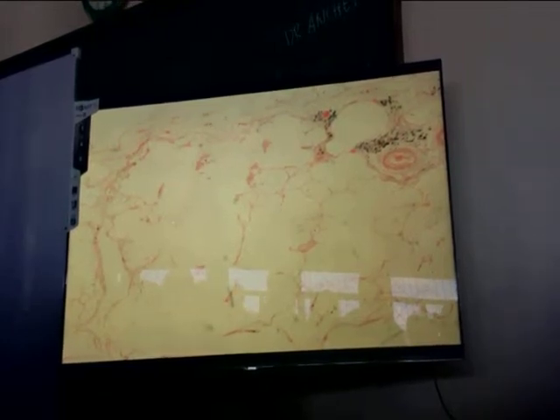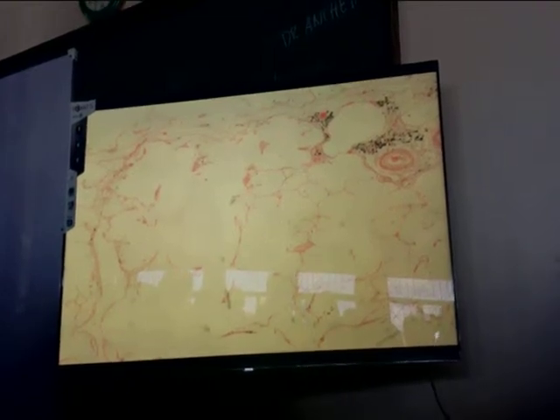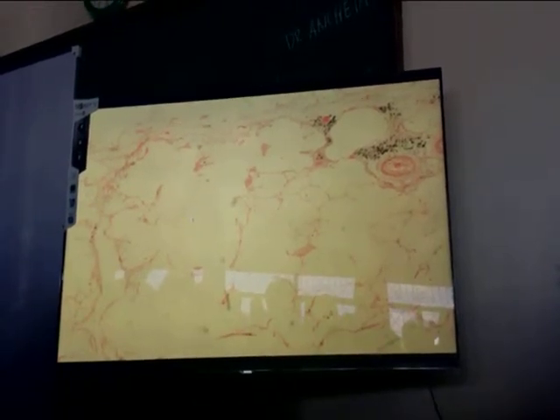That is why we are now able to see dilated alveoli instead of that normal size of an alveolus. So these pointed alveoli are already markedly dilated because some portions of their wall were already digested by the elastases produced by, or released by, the macrophages.